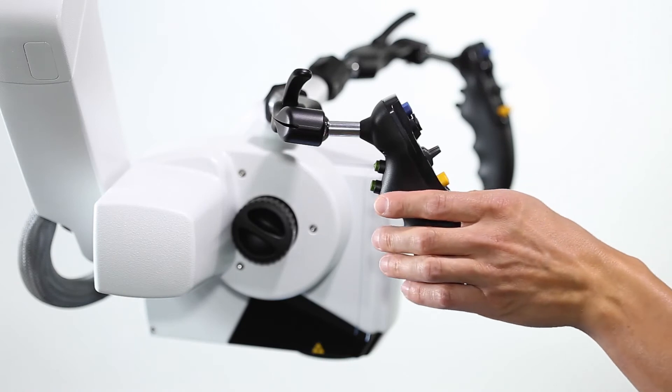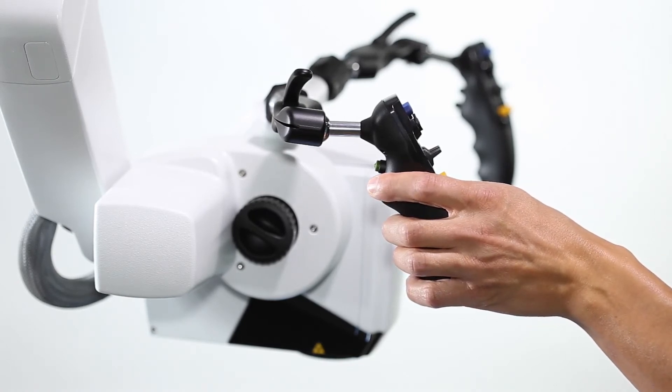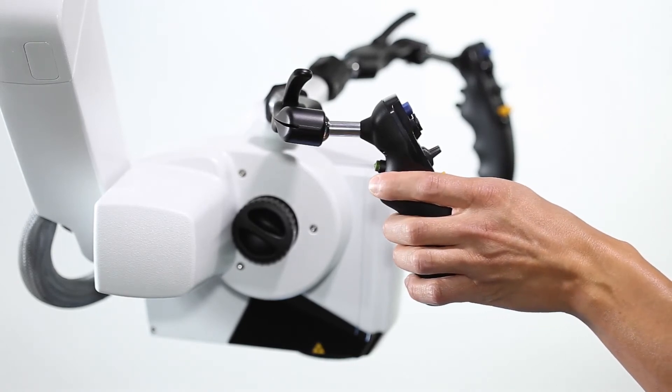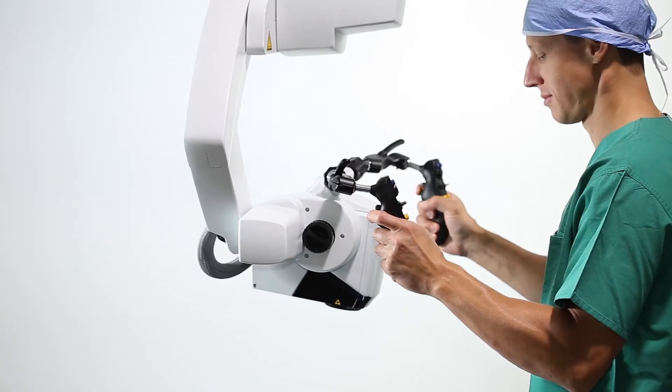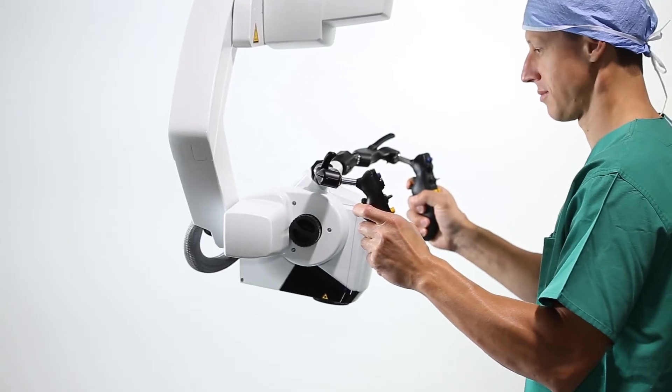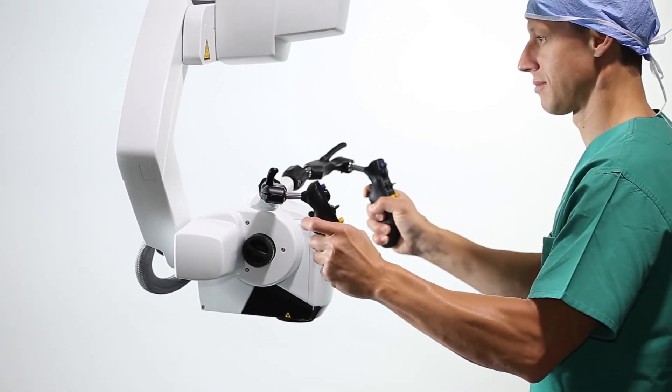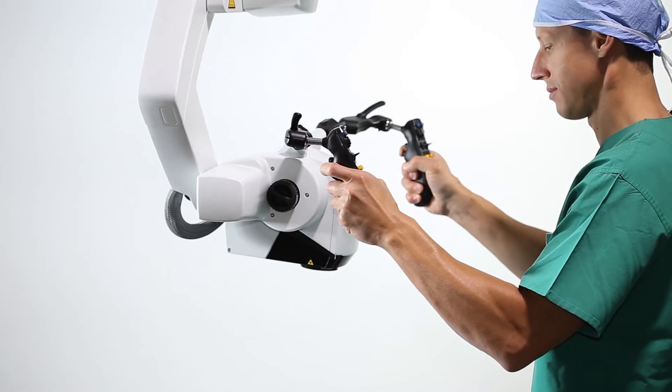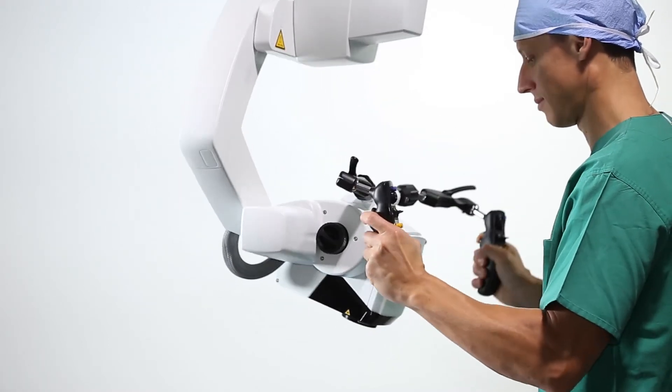The lower green button releases all brakes of the stand, as well as the visualization head, providing full flexibility to position Zeiss Kinevo 900 at any angle and position within its movement range.